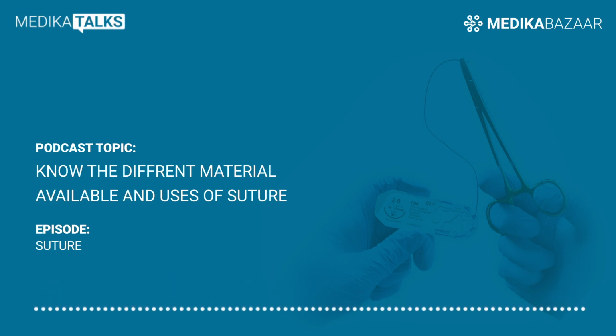The application of a suture essentially involves the use of a needle along with an attached thread. Today, doctors have access to a wide variety and type of surgical sutures of different sizes, shapes, and thread materials. Most people often confuse the word suture with stitches. However, a suture is simply the name of the medical device used by the doctor to repair the wound, whereas stitching is merely the technique the doctor uses to close the wound.